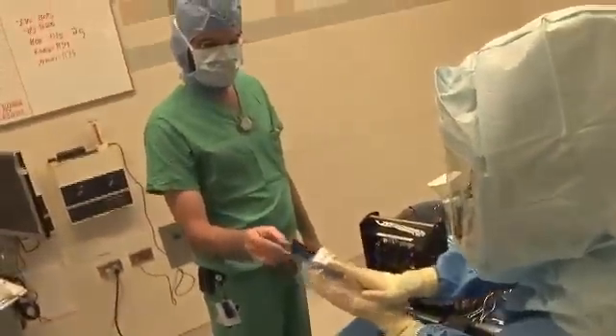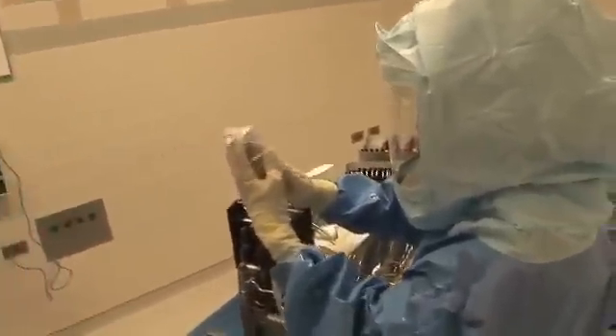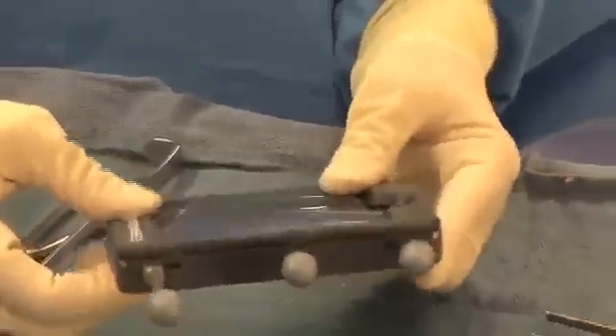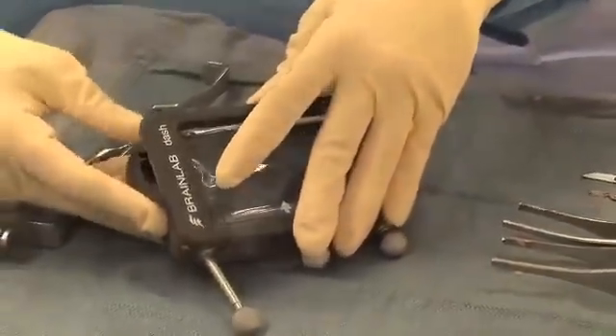The way it works is, there's a cradle — you pop the sterile iPod, which is put in a sterile pouch during surgery, into the cradle. There are sensors attached to this cradle, which is attached to cutting guides used to help align up your knee replacement implant.